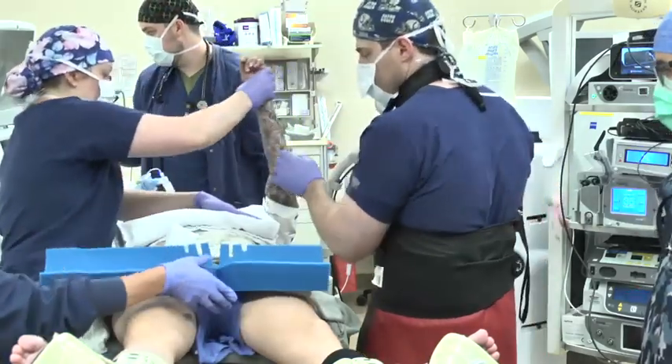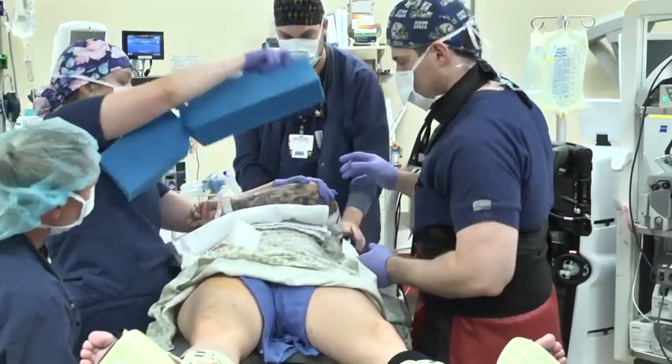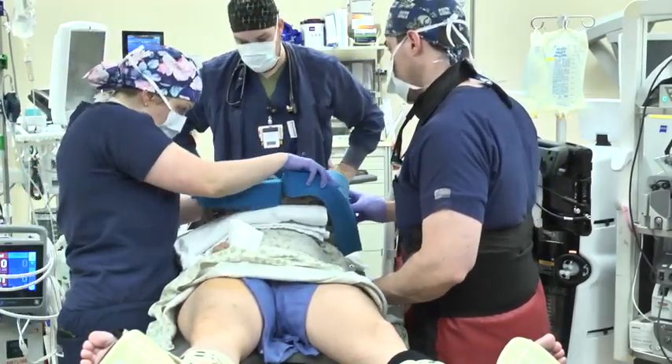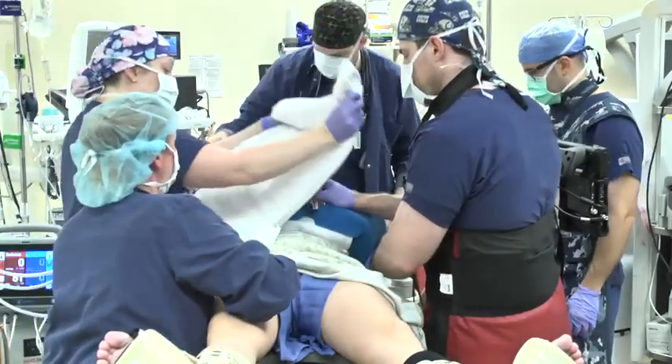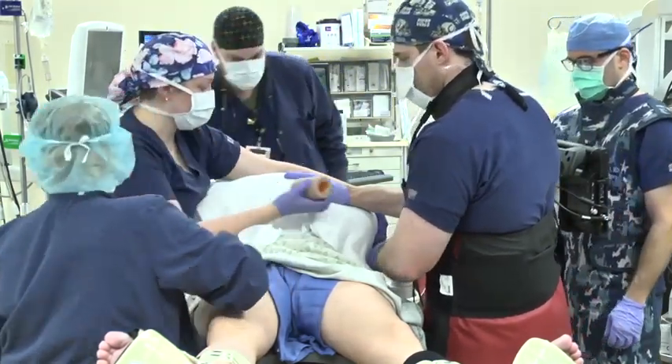The patient's arms are positioned folded onto the chest. A blanket is first placed on the patient's chest with the arm with a blood pressure cuff placed first. The first arm is padded with an egg crate cushion. Then an additional blanket is placed on top of the arm with the IV arm placed over the pad.